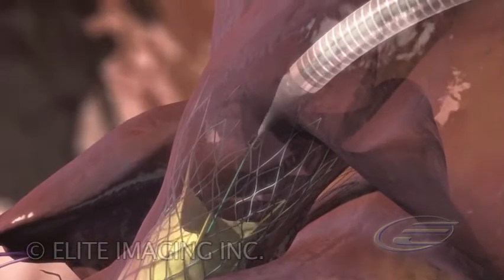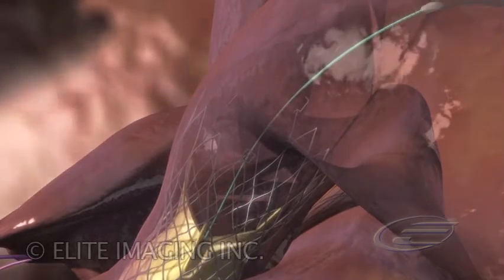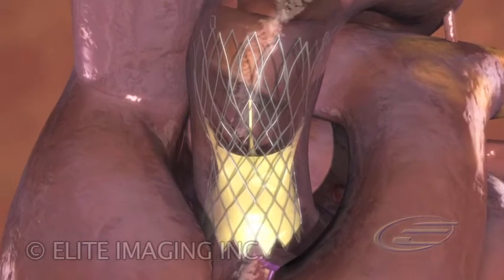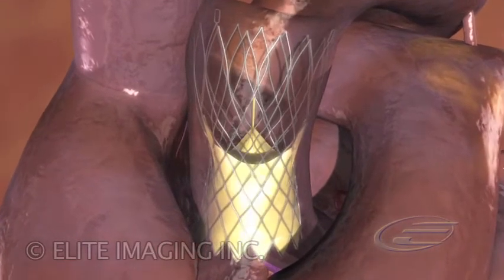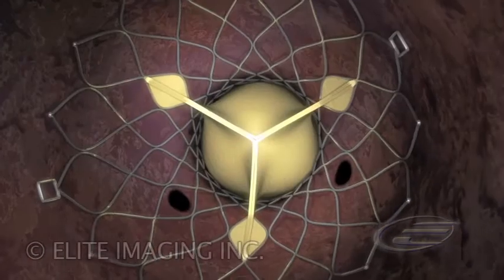The catheter is closed and retrieved. The central level of the frame is concave to prevent obstruction of, and allow access to, the coronary ostea. The upper level expands in the ascending aorta, ensuring proper orientation to blood flow direction and additional anchoring.